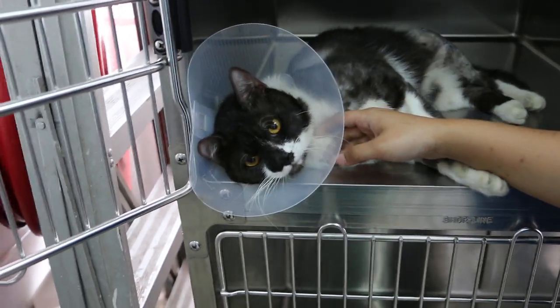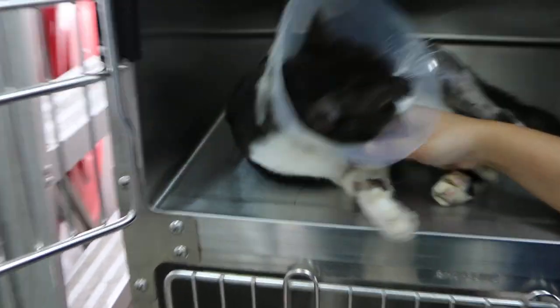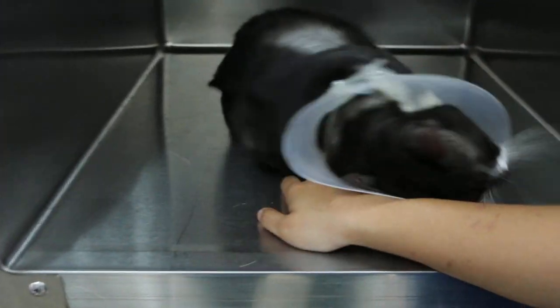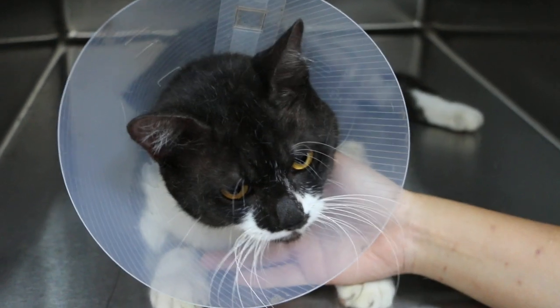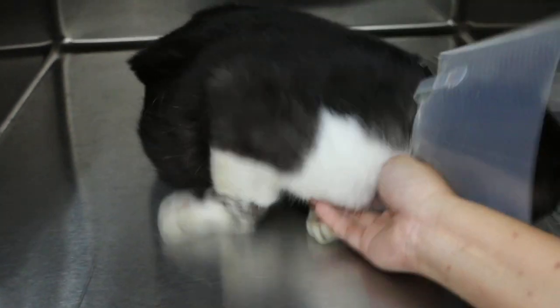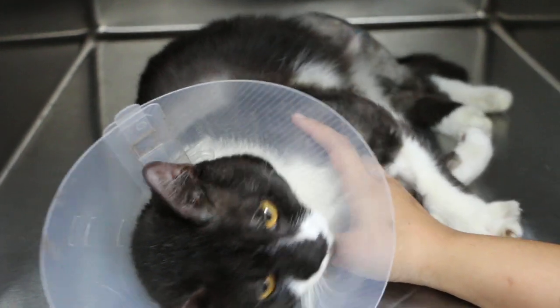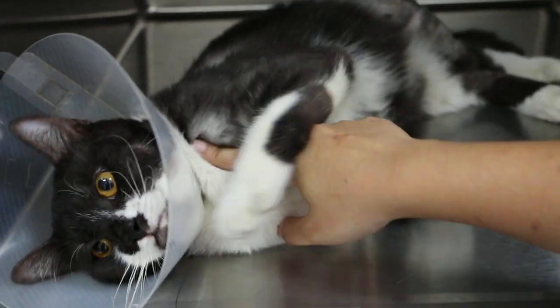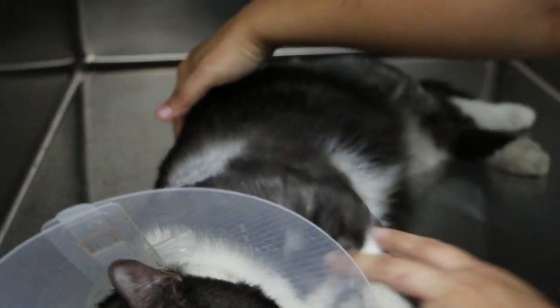To BioVets, today is 10 July 2018, and today is 8 days from the surgery. This 20-year-old male neutered domestic short-hair cat fell from a height and fractured his left hind leg.